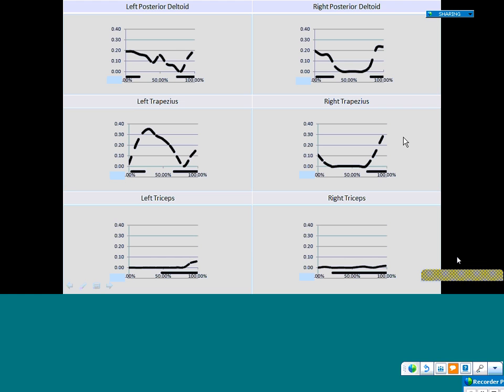So while in this scenario there might be activity in the beginning and the end for all push strokes, and maybe only a couple push strokes show activity at this 50%, it's going to be reflected in these graphs. I'm not excluding any data. I'm looking at 10 consecutive push strokes. So that may explain why some stuff does not match up exactly.